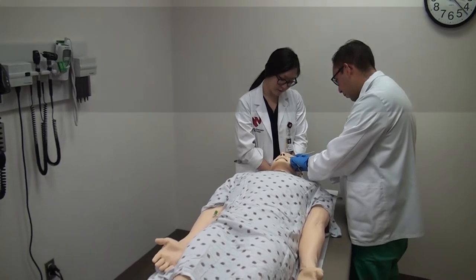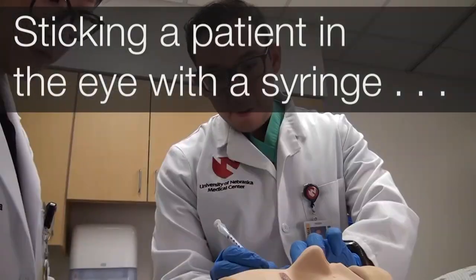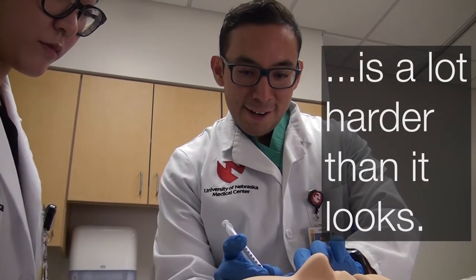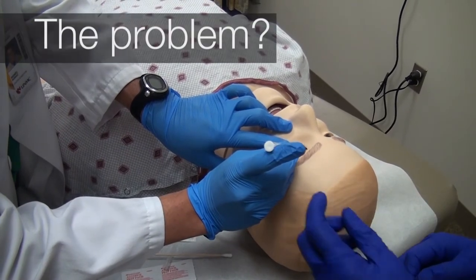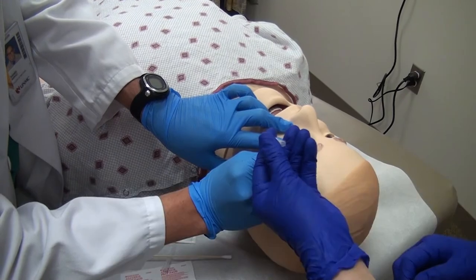Hold up there for about 20 seconds. When I keep my controls, I kind of hold it close to the needle. So it's in now, and I need to kind of go back and try it out. It's rather difficult with you. Stabilize. Put that in. Awesome.